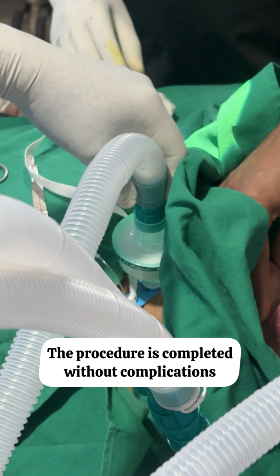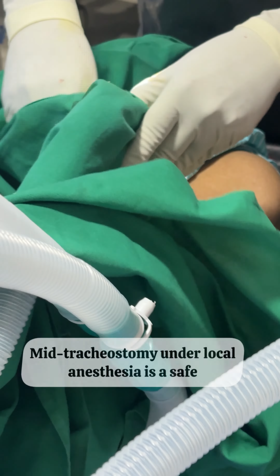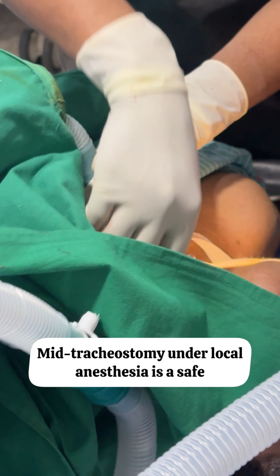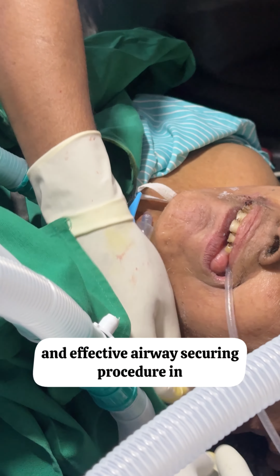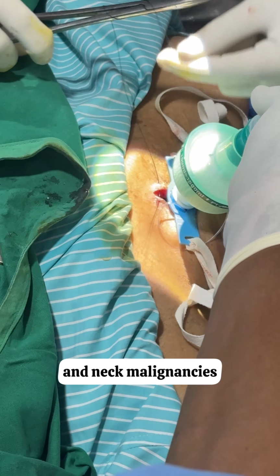The procedure is completed without complications, and the patient remains hemodynamically stable. Mid-tracheostomy under local anesthesia is a safe and effective airway securing procedure in selected patients with head and neck malignancies.